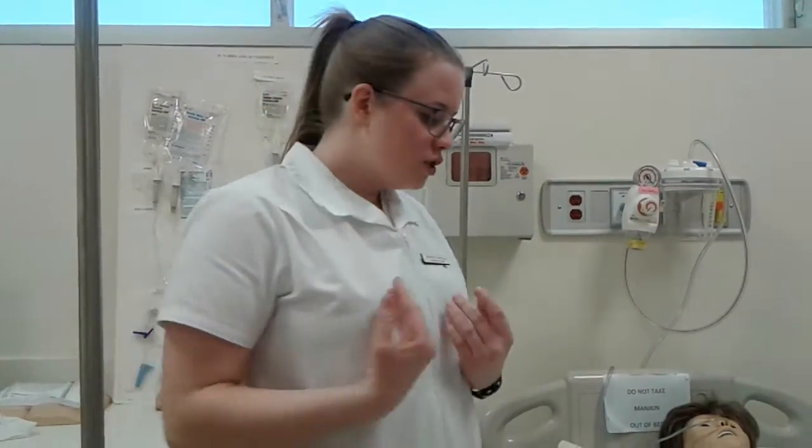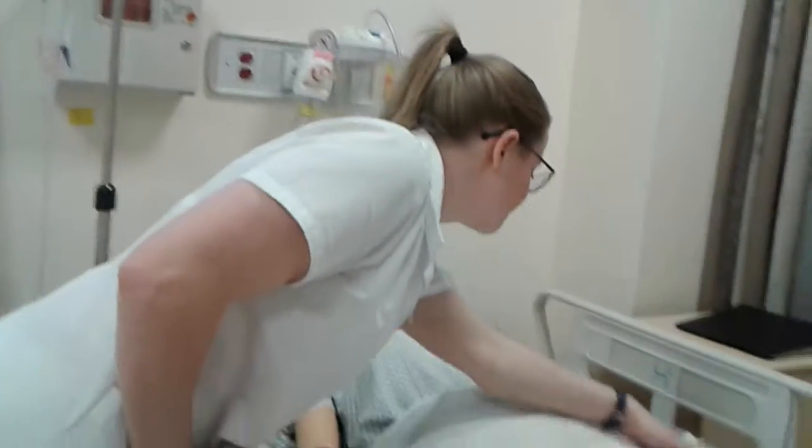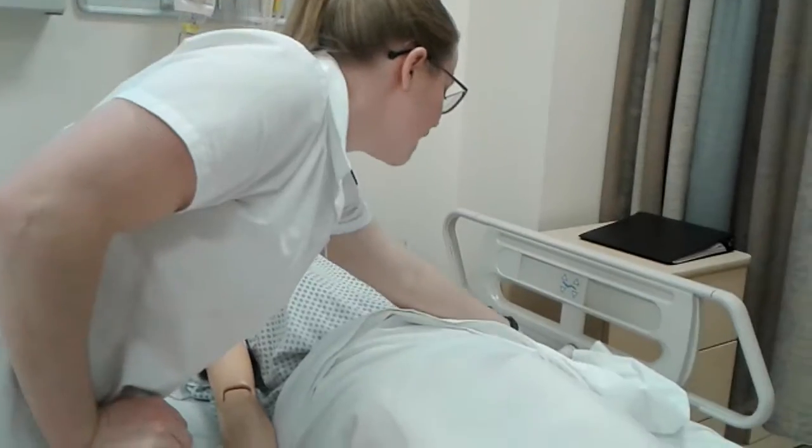So to begin, I would obtain my physician's orders, wash my hands, and gather my equipment. I would need to introduce myself to the patient and identify them, asking them to state their name and date of birth, and comparing it to their ID bracelet. I would then provide privacy and explain the procedure.